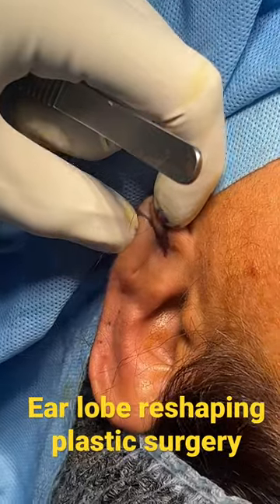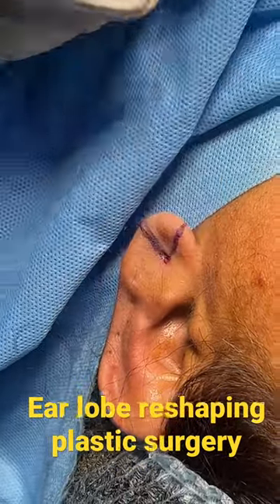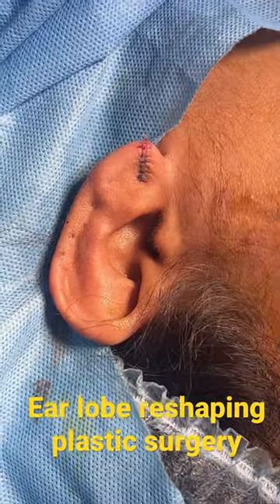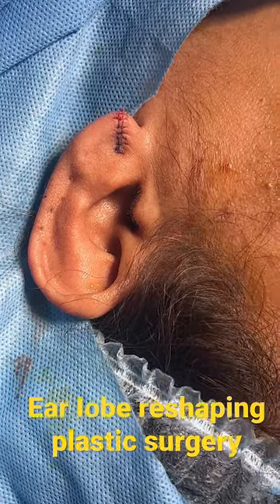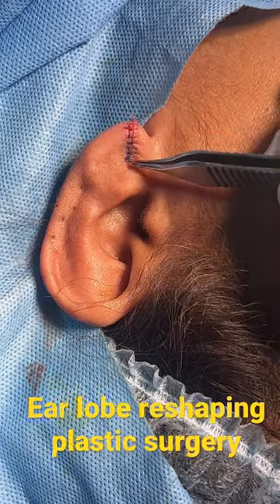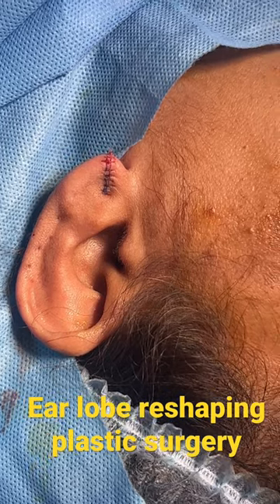We're closing it primarily, so you can see the ear — the lobe is going to get reduced. There you go, now it's sutured up. You can see the lobe is much more proportional to the entire ear. The scar is not going to be visible. Sutures will be taken out at day six, and she's going to get a piercing done again for placing her earrings.